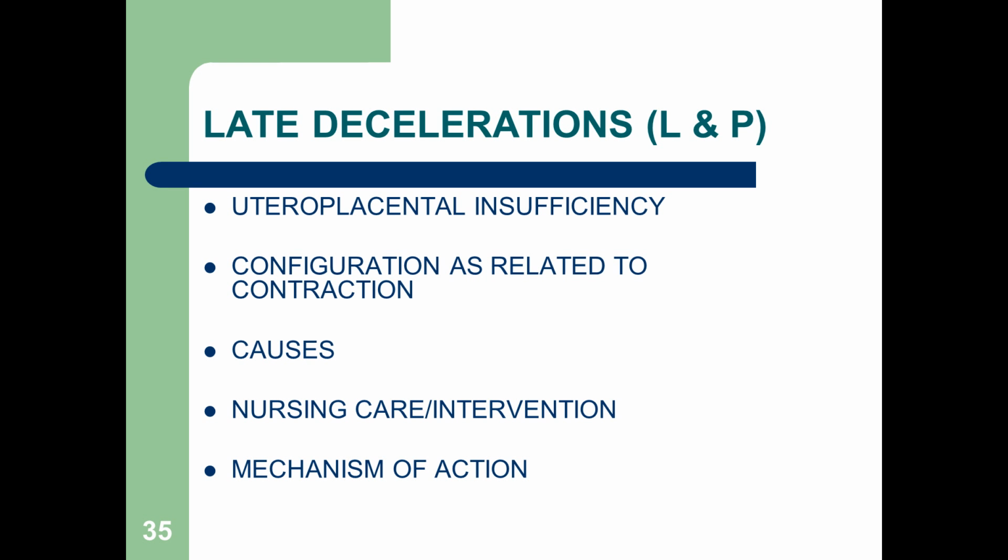So the main thing is you do what's easiest first, change their position, and while you're changing their position, you're going to raise the bed and give them oxygen, all right?